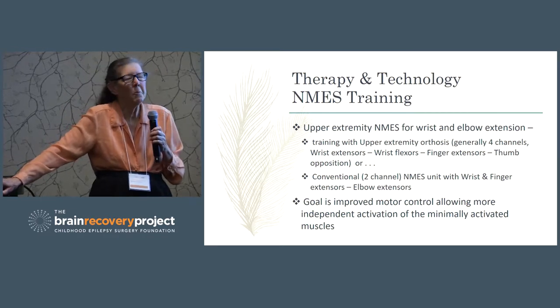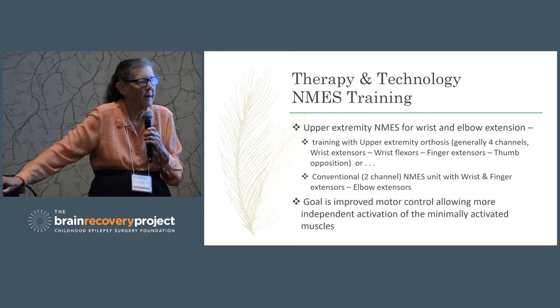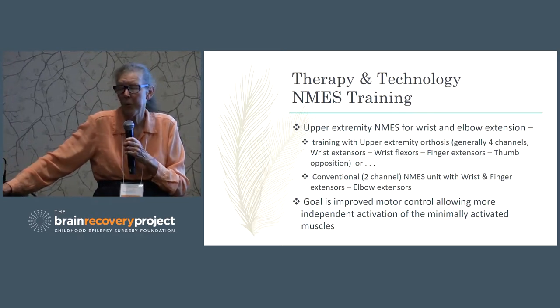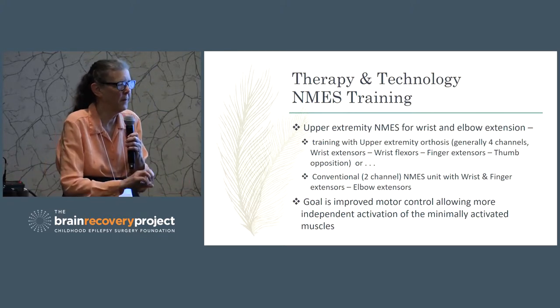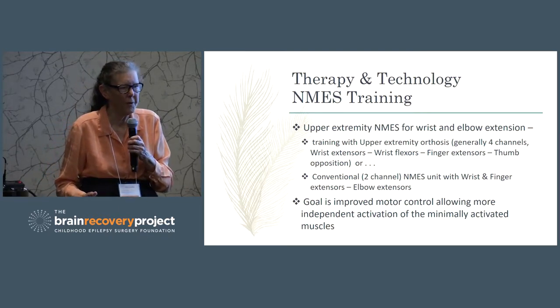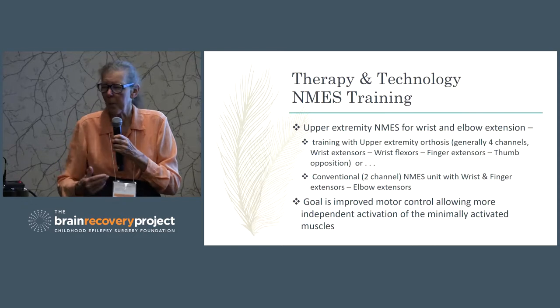So our goal here is to improve their motor control so that they don't have to use it forever. Now, the neurologic damage may be done. And you may have to use starter sessions, if you will. So when I first start off any of these folks on hand control or dorsiflexion control for that matter, I usually use an intensive training program with the therapist involving function. And I do that for maybe a week, 2 weeks, 3 weeks. We see they're gaining function. And then we can start doing a primer session with the stimulation and let them go do their same functional activities without the stimulation. And I wean them off of the stimulation.